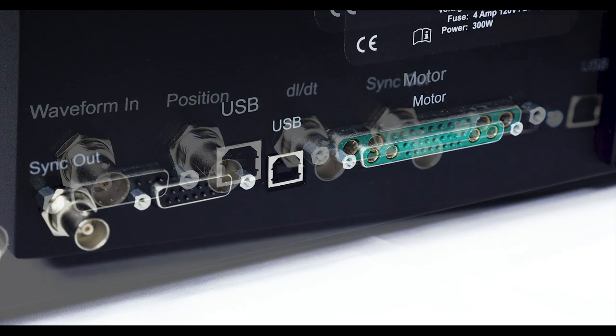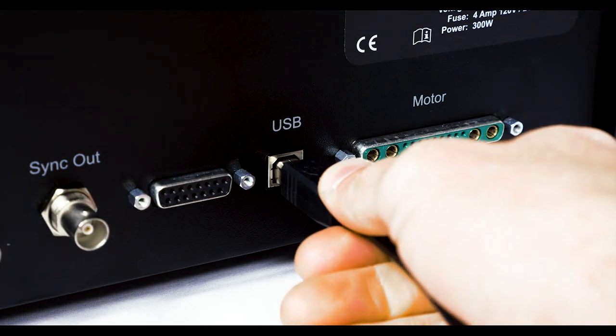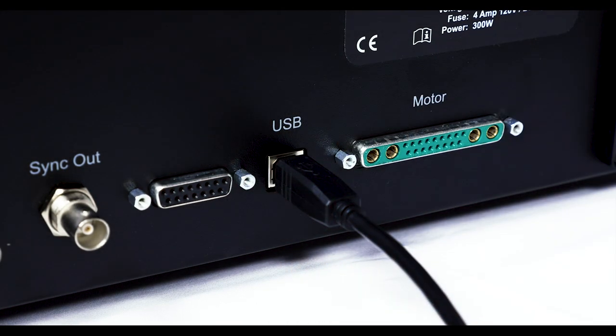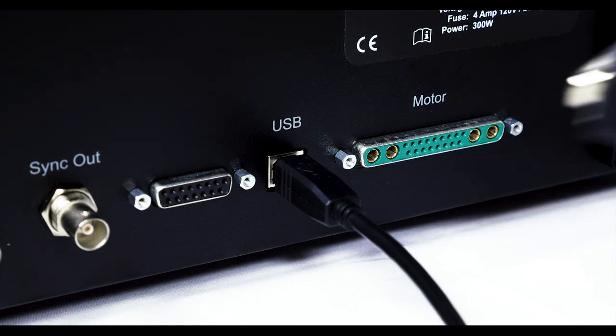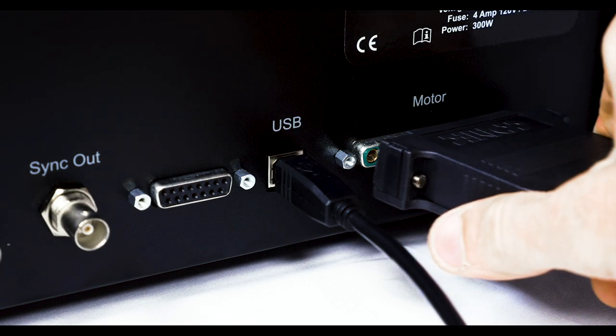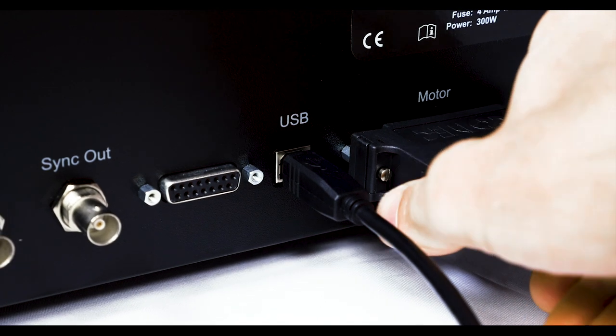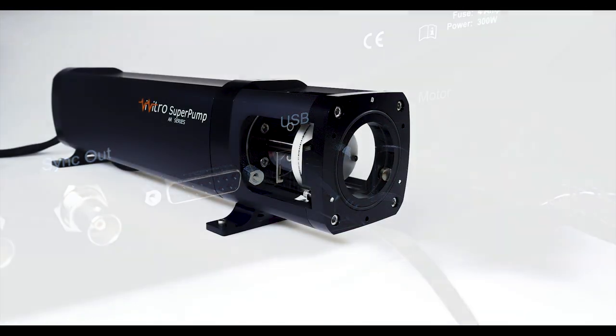Other connections include a USB connector which is used with Vivigen software to upload new waveforms to the internal memory of the controller, and a motor connector which connects the controller to the super pump actuator.